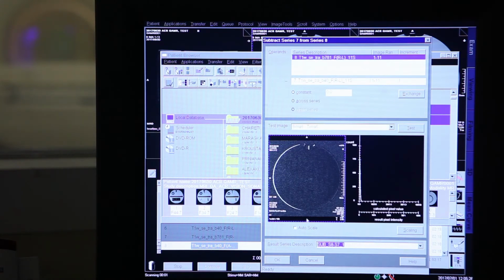This difference, because of subtraction, is an indication of the homogeneity of the system. And if you measure this size in pixels or in millimeters, it can be correlated with the actual ppm, which is parts per million. Measure the width of the meniscus. Width of the meniscus, exactly.